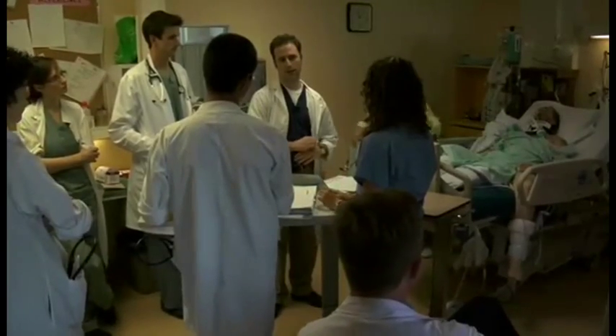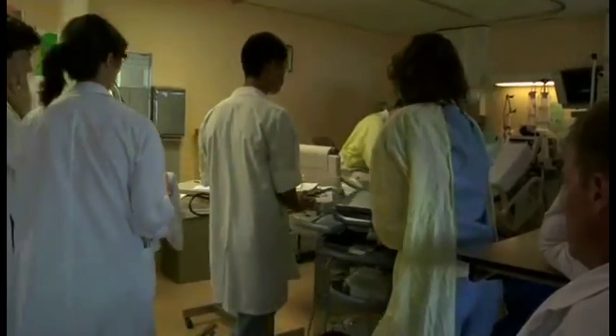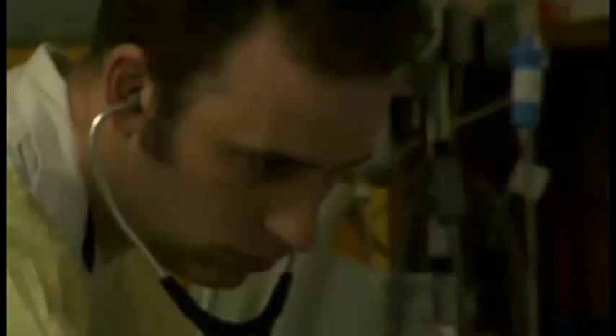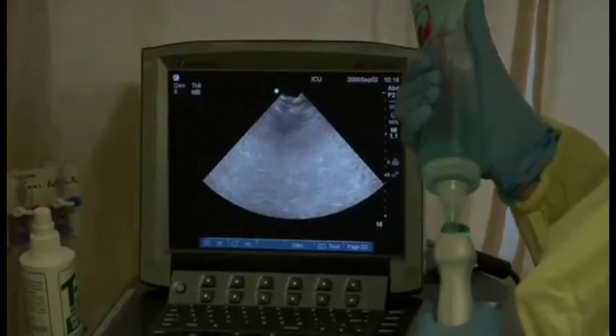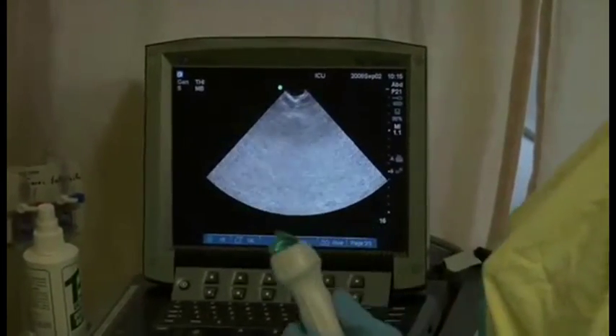This gentleman had a trauma about two weeks ago — a motor vehicle accident. We were wondering if he was fluid overloaded or dry. Ultrasound can give us a precise evaluation: is there fluid, where is it, is it safe to tap, and qualitatively how much fluid is there? When we were giving him diuretics to empty him, he was dropping his blood pressure.